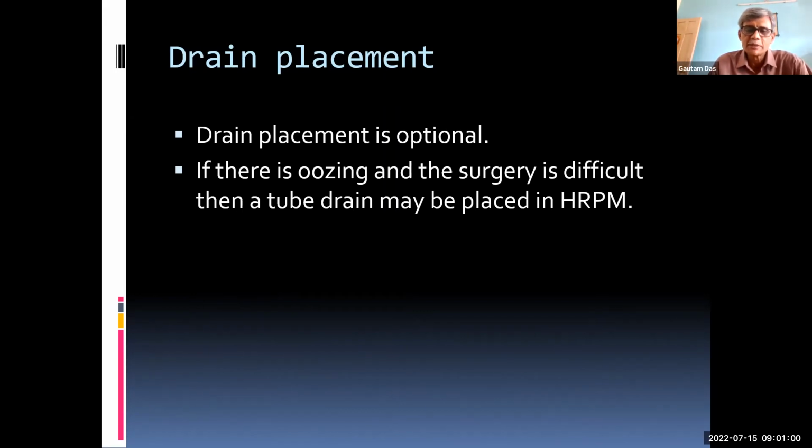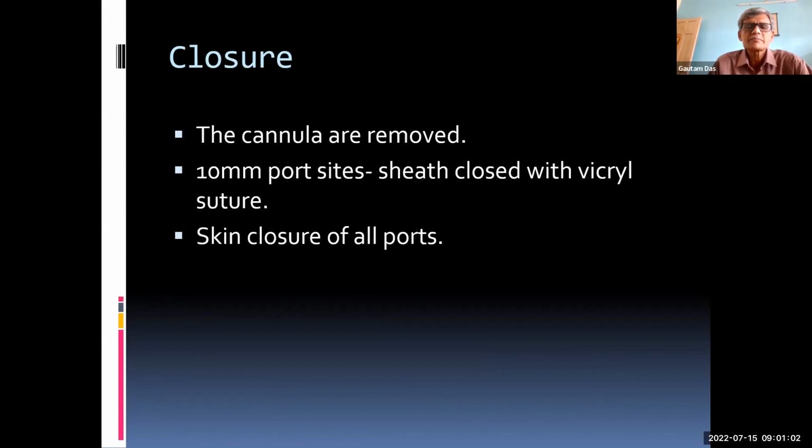Otherwise, you have to place the drain. Closure you have mentioned. There are several techniques of closure, especially for the umbilical port. You can use some form of trocar closure device, or you can place the sutures during the placement of the initial trocar and then close it.